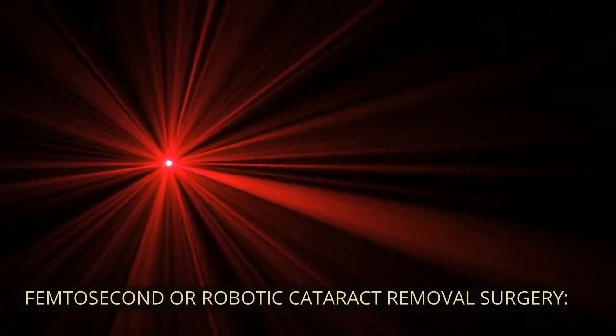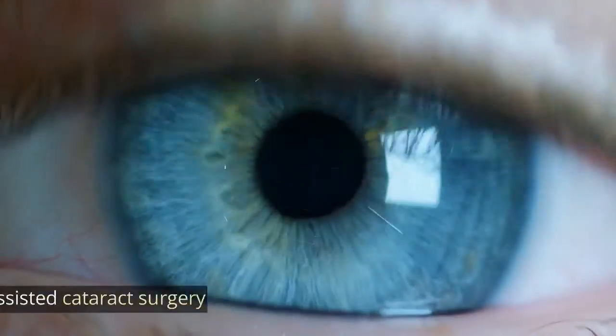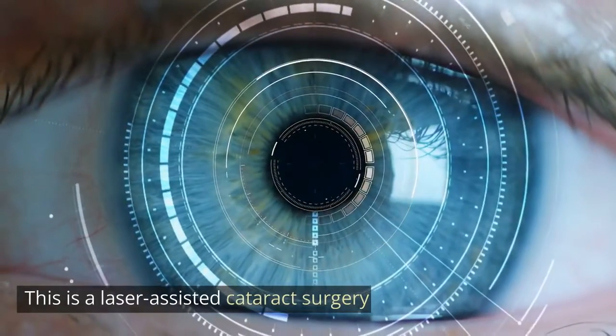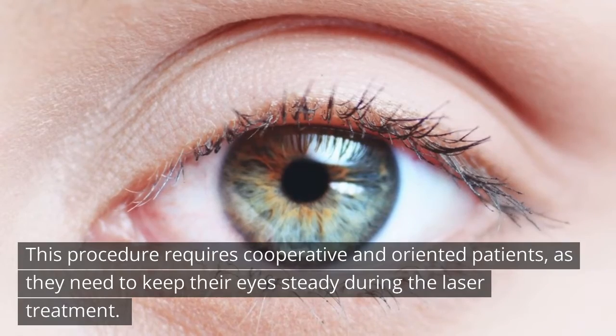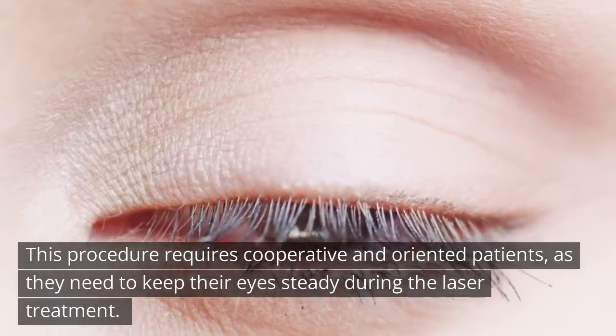Femtosecond or robotic cataract removal surgery. This is a laser-assisted cataract surgery. This procedure requires cooperative and oriented patients, as they need to keep their eyes steady during the laser treatment.